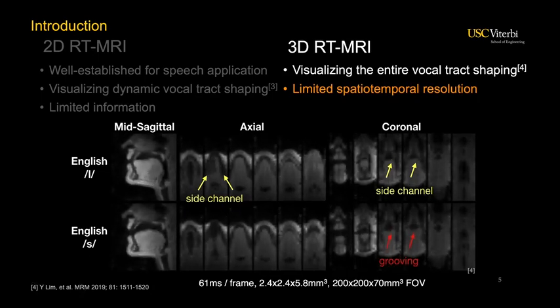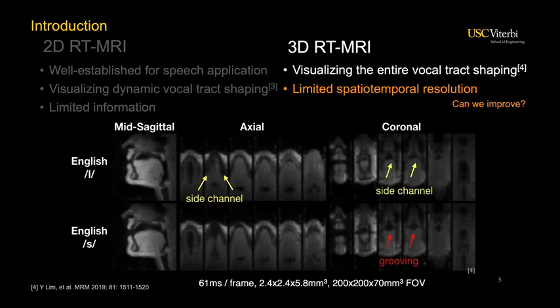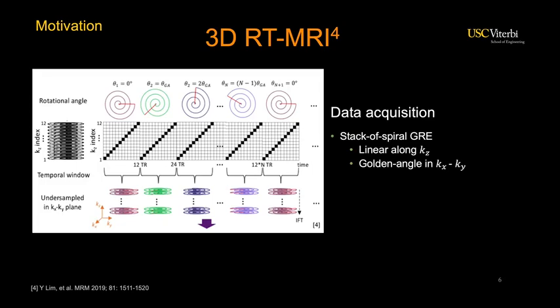However, the spatial and temporal resolution has to be compromised if we push to the 3D, so the question is raised, can we improve that? Our motivation comes from the current imaging protocol of the 3D real-time MRI. Let's take a close look at this data acquisition.